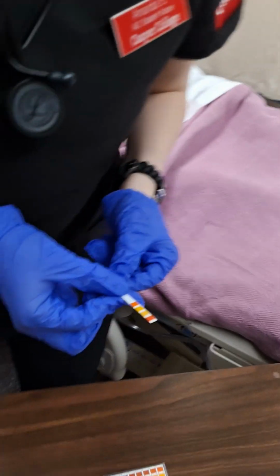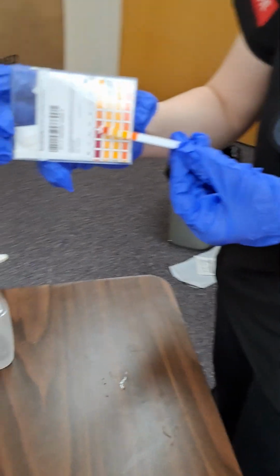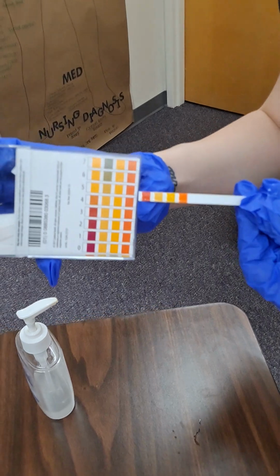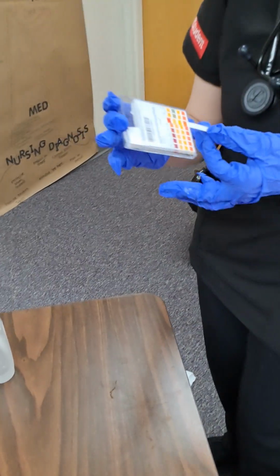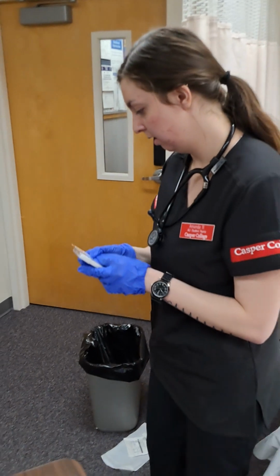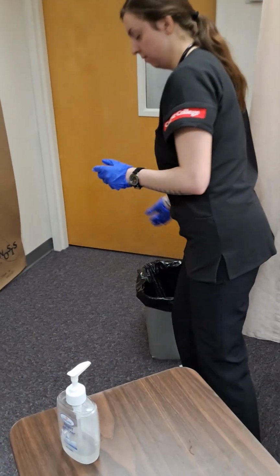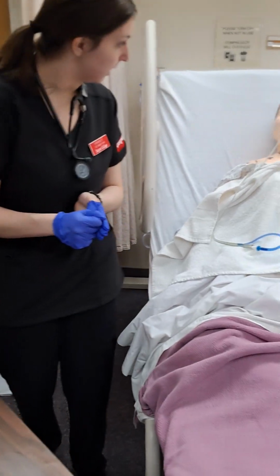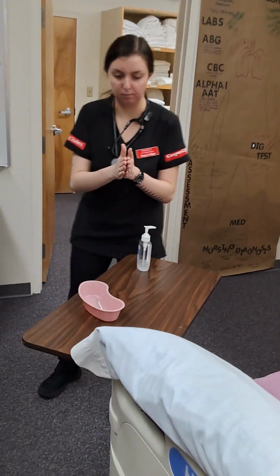And now I am going to do the pH. So I do see that it's around 4. Yep, 4. So we are in the stomach, but like I said, he will have an x-ray to confirm that. Now I will throw this away. Would you like some oral care done? Yeah? Okay. I'm going to take off my gloves, sanitize my hands.